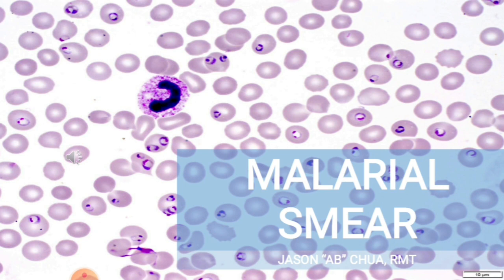Systemic or blood-borne parasitic infections are diagnosed by demonstrating the diagnostic stages of the responsible parasites in a blood specimen. Parasites that may be recovered in blood include Leishmania donovani, Trypanosoma species, Plasmodium, Babesia, and Microfilariae group. The proper collection and handling of blood specimens is essential to obtain adequate smears for examination.